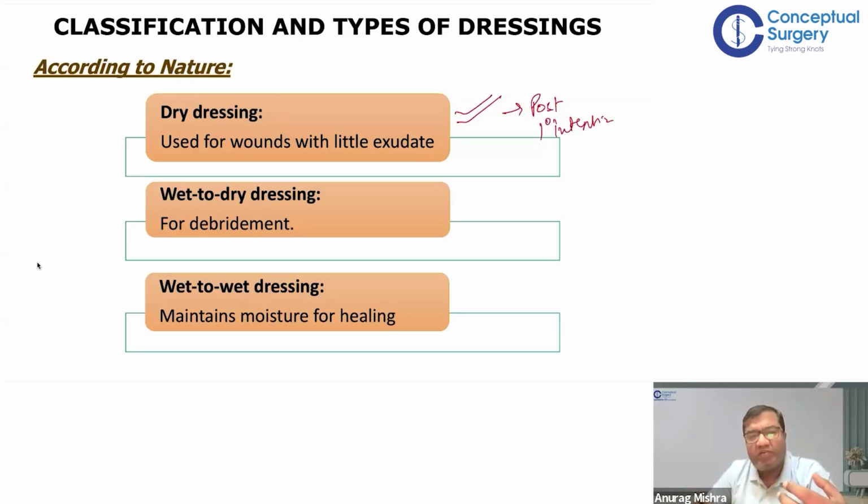Now, sometimes we do debridements where the wound is wet, meaning it is causing secretions, and we want the dressing side of it to be a little dry. We don't want the dressing to be wet.